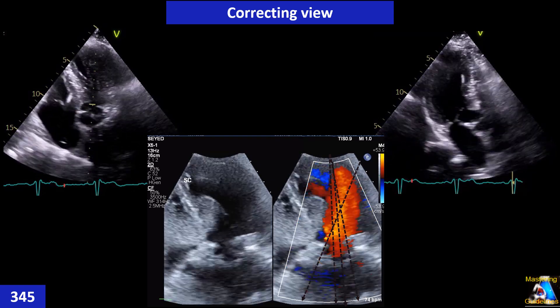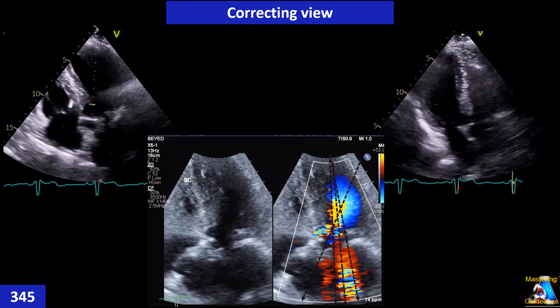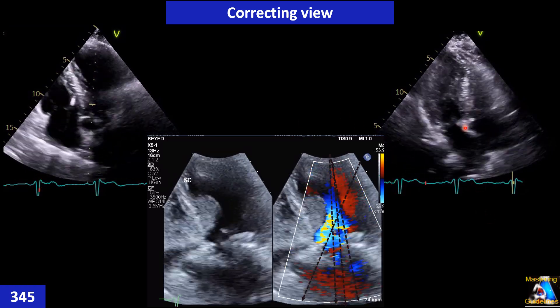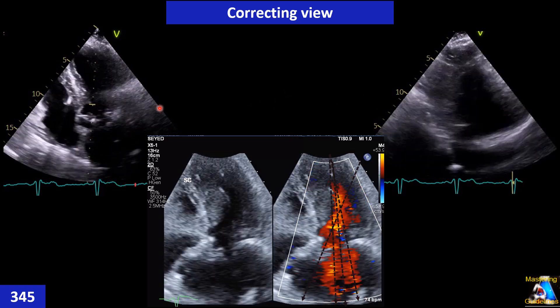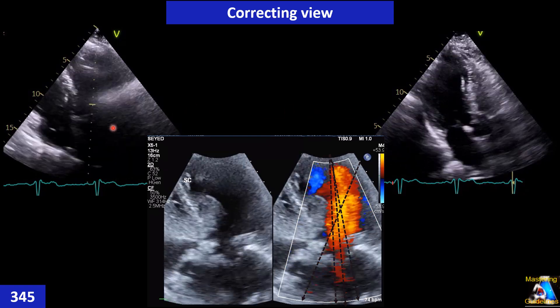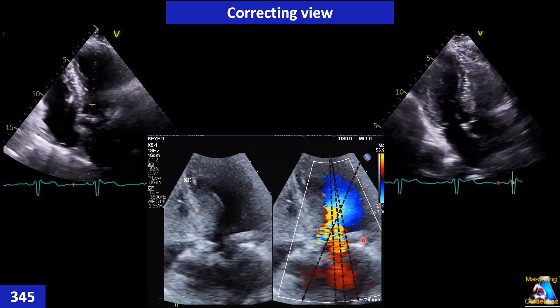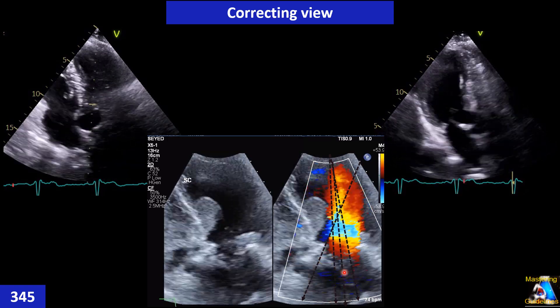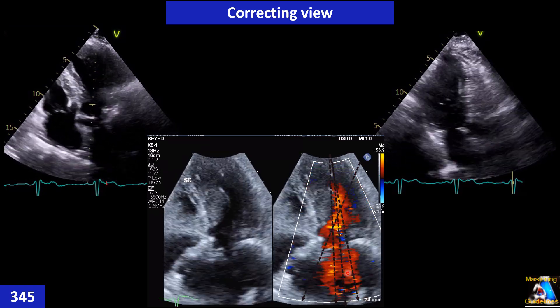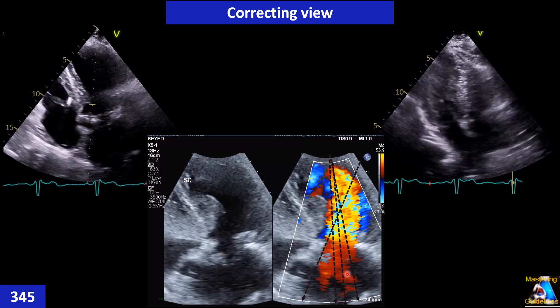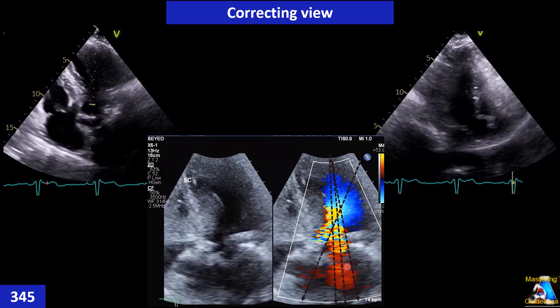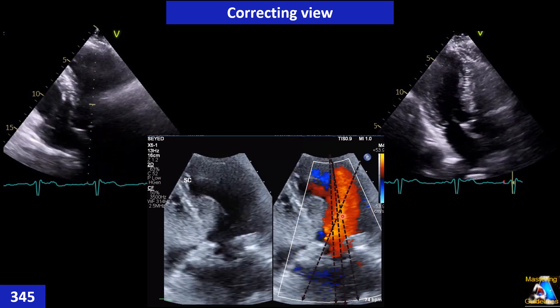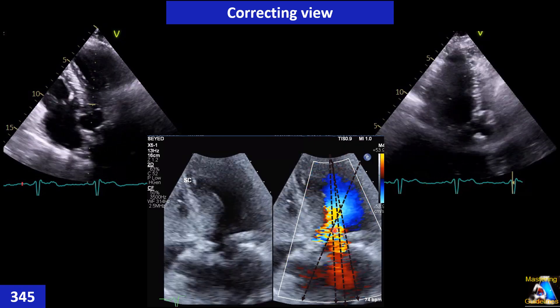During this practice session we fix our image, because with Valsalva the heart and the apical 5 and apical 3 views change significantly. We also assess mitral regurgitation — both at rest and with Valsalva — to evaluate its severity, shape, and mechanism. If the patient has MR, we must differentiate the MR jet from the LVOT or intracardiac jet, because they occur at the same time (systole) and in almost the same direction when we place the cursor.